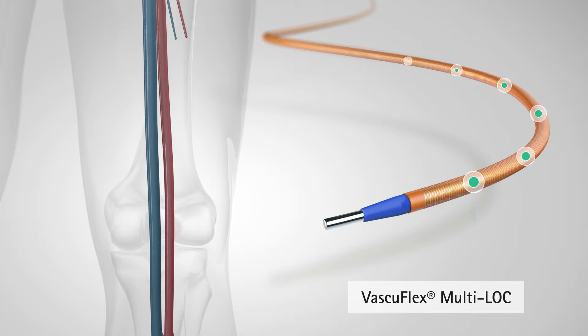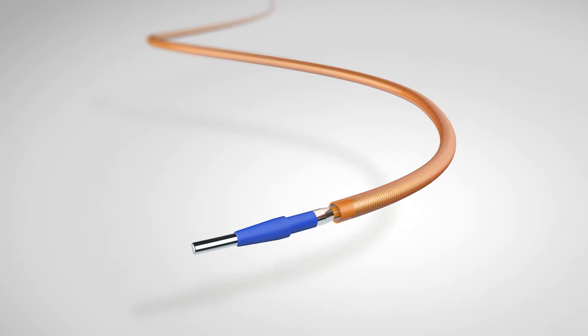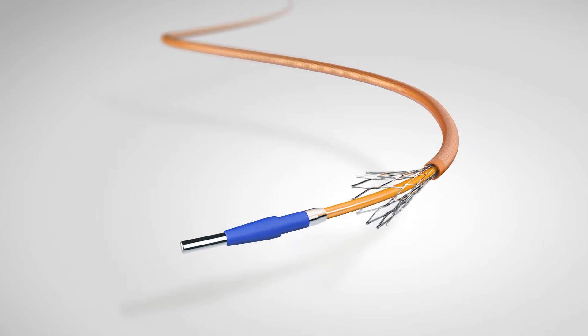With six short stents mounted on one delivery system, VascuFlex Multi-LOC enables spot stenting only where it is really needed. Each self-expanding nitinol stent has a high radial force.